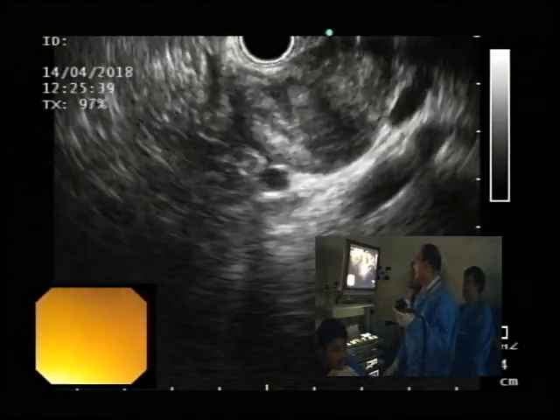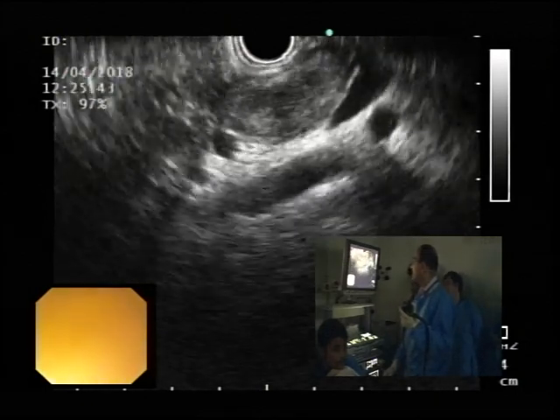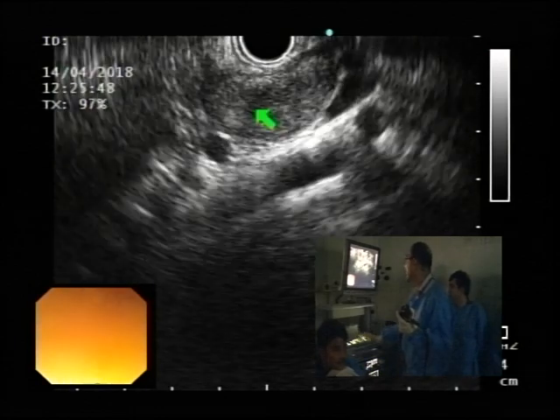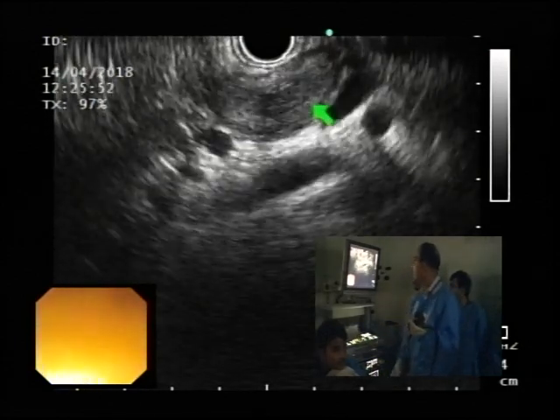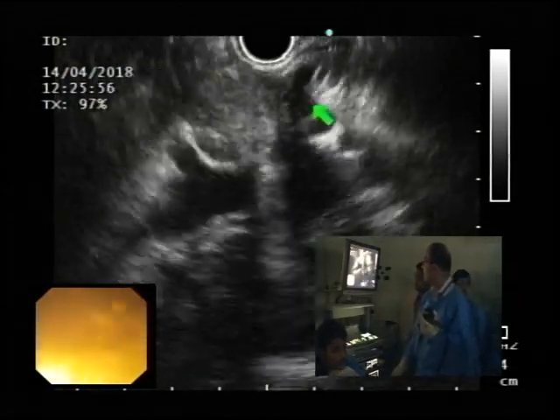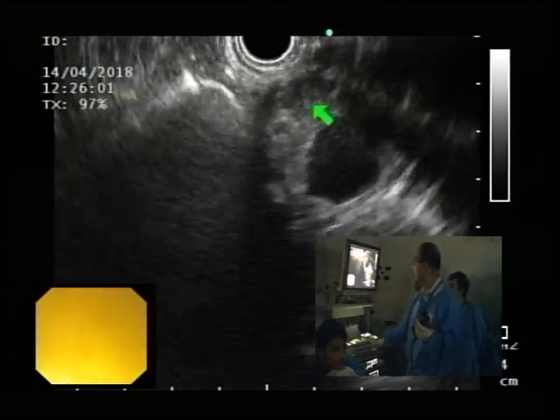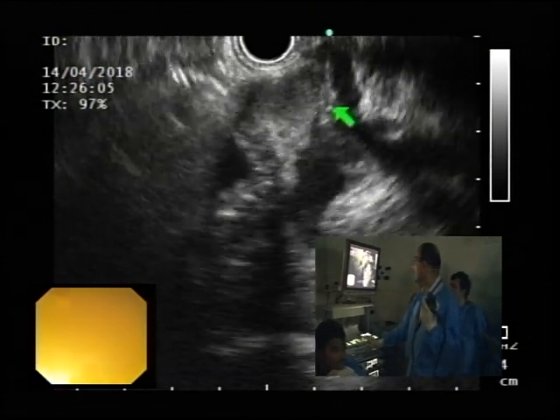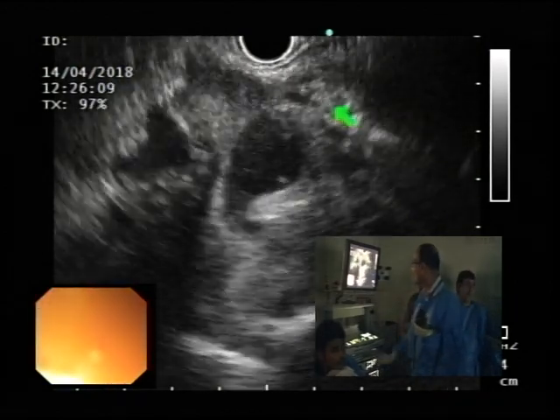But honestly on this exam it is hard for me to make out the duct as well as what is abnormalities in the pancreas versus changes related to inflammation. यहाँ से as I go counter, then you can see the pancreas dipping down. और यहाँ पे मुझे लगता है कि थोड़ा सा duct we are seeing about here. Yeah, we can see that, right? Yes, there. Yep. Though actually now that I look at it some more, this is actually the duct.